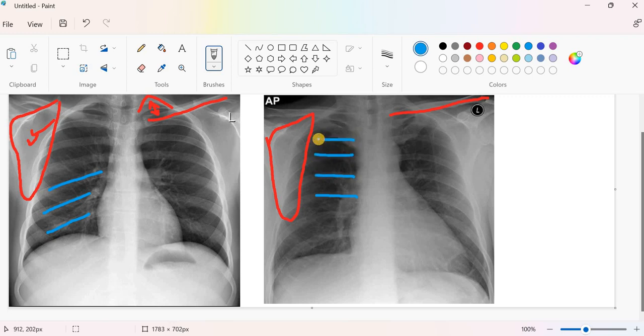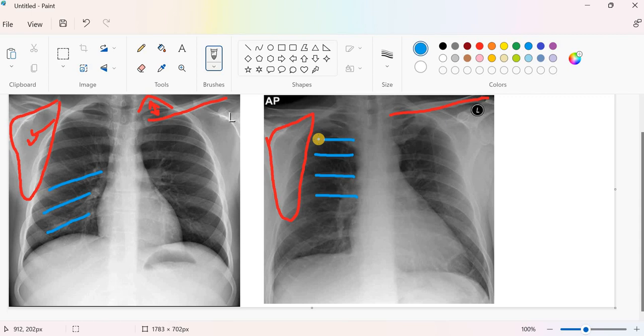The last point we should look at and comment on is the size of the heart. Size of the heart is not preferable to be commented about in case of anteroposterior chest X-ray, because usually anteroposterior view chest X-ray is giving us false highly magnified size of the heart. That means it will give you false impression that this patient has cardiomegaly while he hasn't.